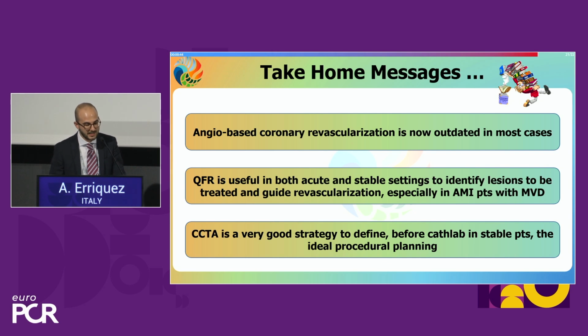And this probably especially in patients with acute MI and multivessel disease. And on the other side, the CT coronary angiography is a very helpful and good strategy to define an ideal procedural planning for the revascularization of stable patients before referring them to our cath labs. Thank you for your attention.